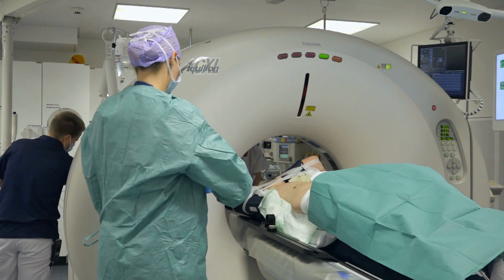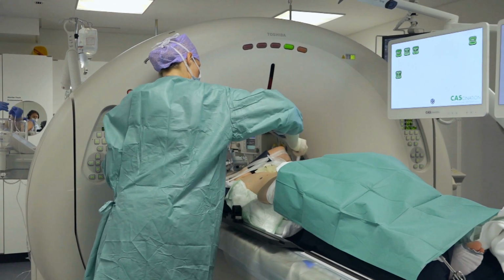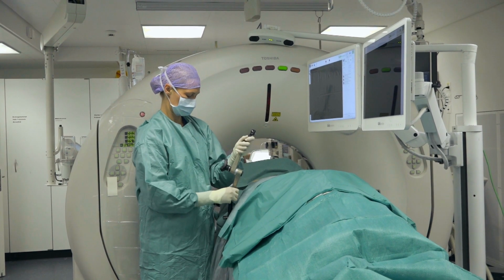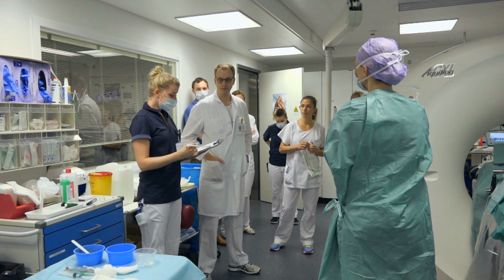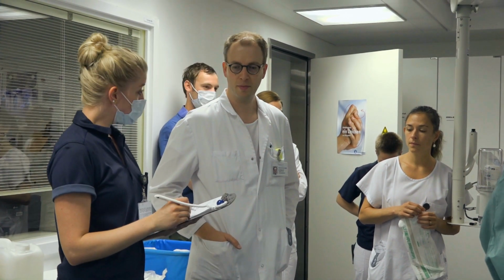The interventionalist preps the patient and prepares the navigation system. Finally, the navigation arm is attached to the carbon board placed below the patient. This overview shows the complete setup before the intervention begins. The intervention starts with a timeout to introduce team members and to discuss the patient's treatment plan.